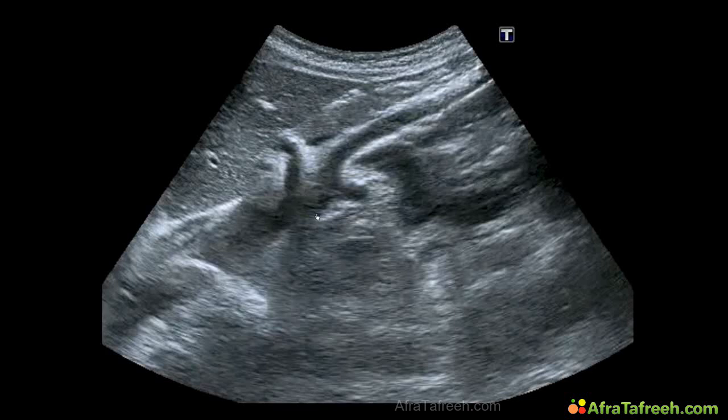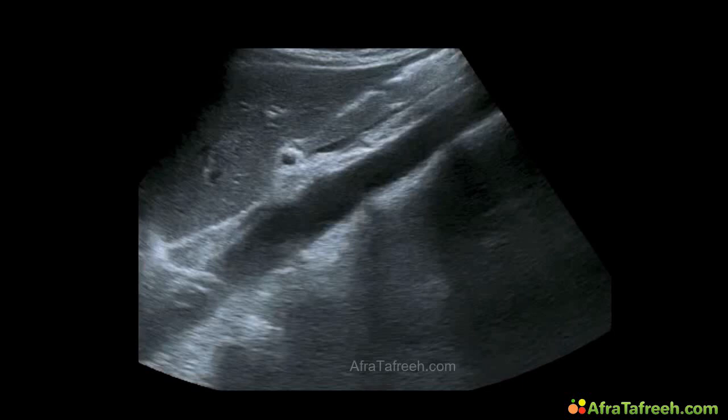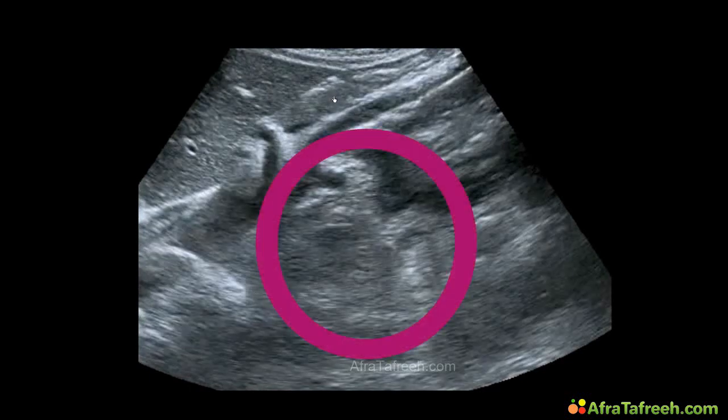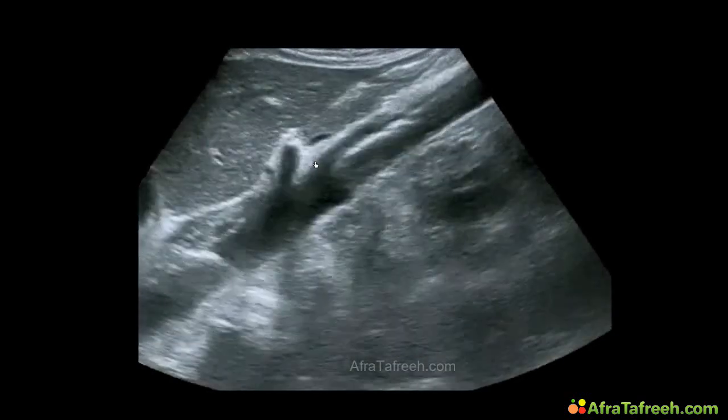So the landmarks in the longitudinal plane are the abdominal aorta, SMA, and maybe the splenic vein if seen. So we can find the pancreas in the longitudinal scan. Check once more the transverse view. We see abdominal aorta, SMA, splenic vein, and in the longitudinal scan, aorta over here, SMA, and over here, the pancreas. I know it's not so easy, but when you keep in mind what we have seen in the transverse plane, it's getting easier, I think.